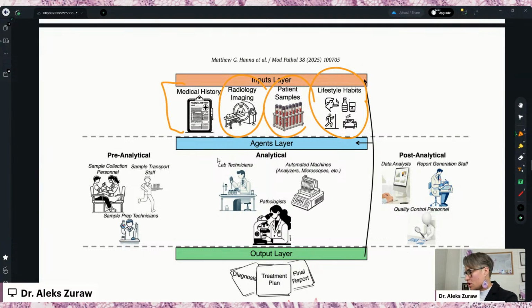And then we have the agents layer. These agents can work with the data and retrieve data, but they can also help the medical professionals actually doing the work and generating the data by helping schedule appointments, helping them actually get the report on time, like sending automated emails that something is ready so that they don't have to go and check, having some kind of notifications, even maybe deploying some machines, but basically they can help coordinate the work of the team.